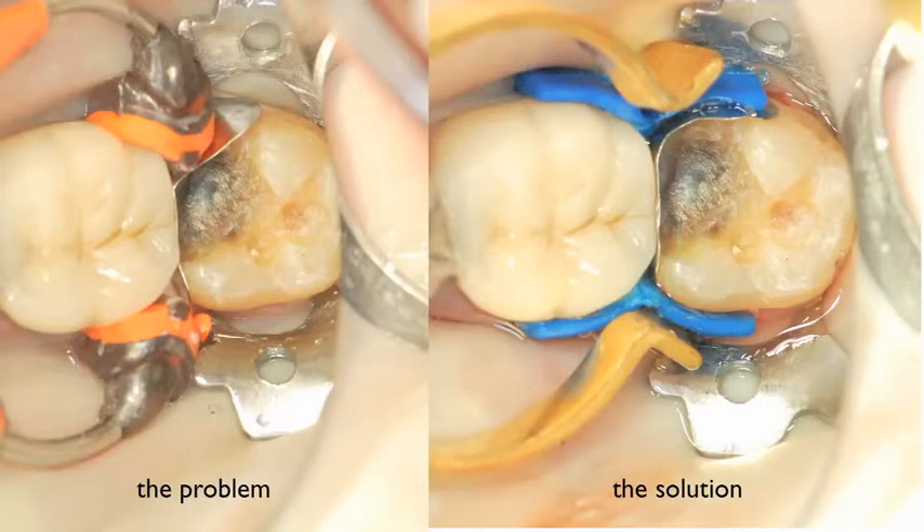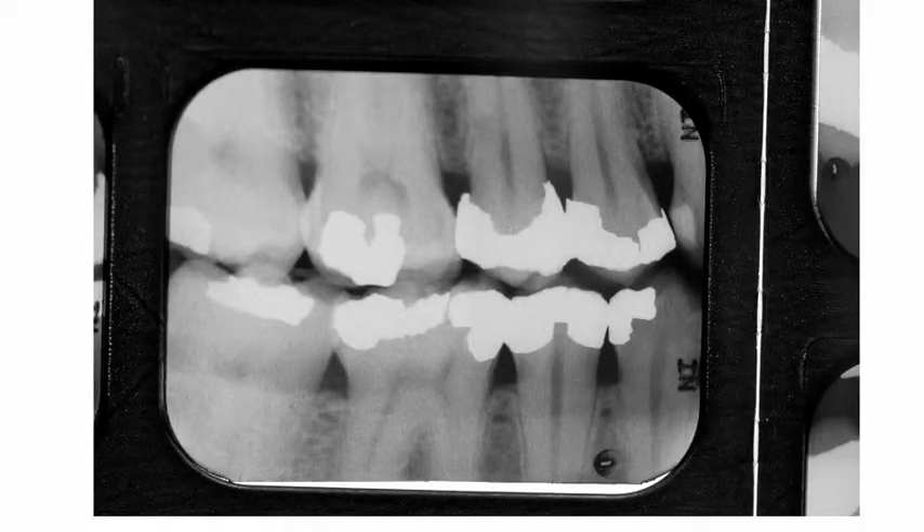The ABC Wedge is the solution for a common problem. When attempting to restore a very large Class II lesion or a tooth with a fractured cusp, the traditional separating rings will crush the matrix band into the preparation. On the left is a clinical photograph of the problem. The solution is shown on the right, utilizing a pair of left ABC Wedges. The original dental wedge was designed to be placed between the teeth to prevent excess amalgam from being pushed beyond the gingival finish line and preventing an overhang.